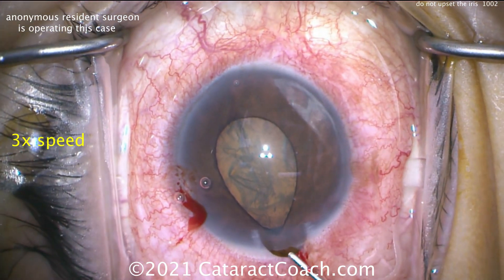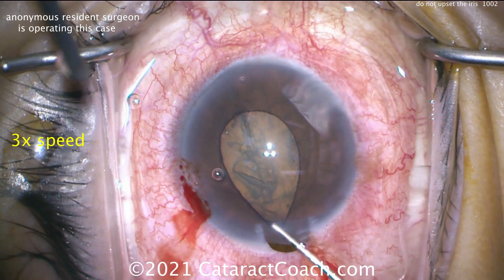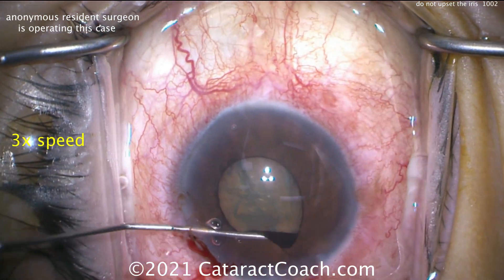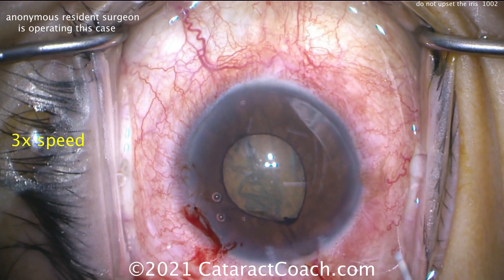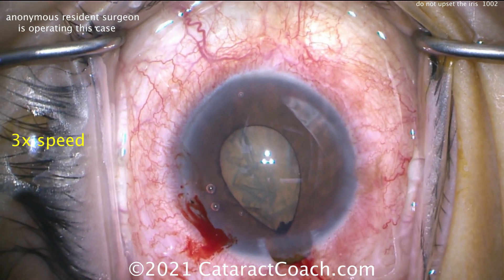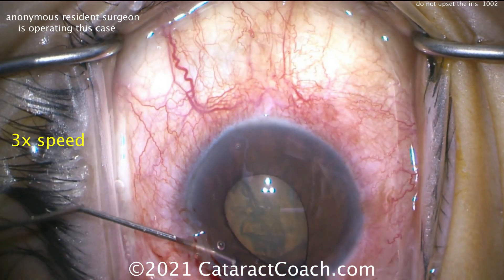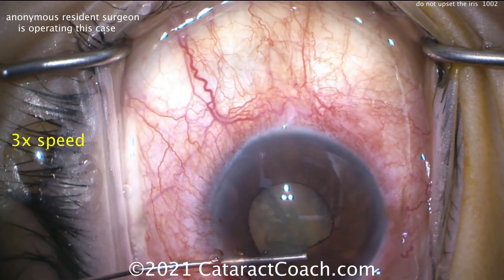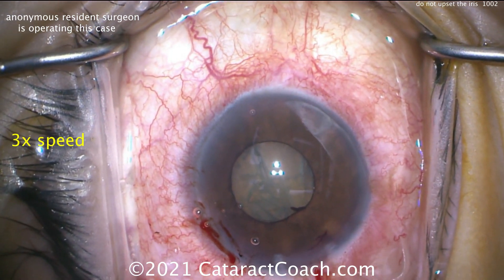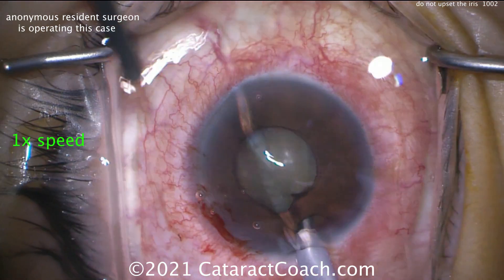Iris prolapse — oh, this is not going to be easy. Once you upset that iris, you're going to be in a world of trouble. There's the iris prolapsing out of the incision. Sweep it back in the eye. At this point we're still okay — it's not terrible. As long as you have enough hydrodissection, you can still get that nucleus removal done. The pupil is still reasonable enough — you don't have to put in a pupil expansion device at this point. Let's get that phaco probe in the eye.